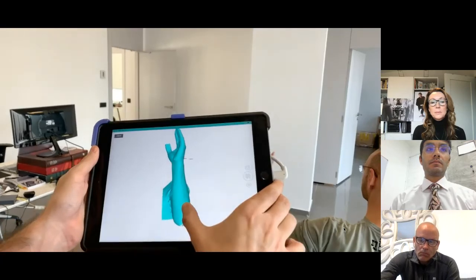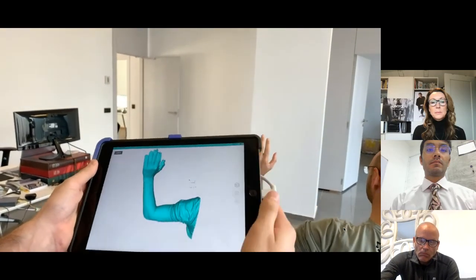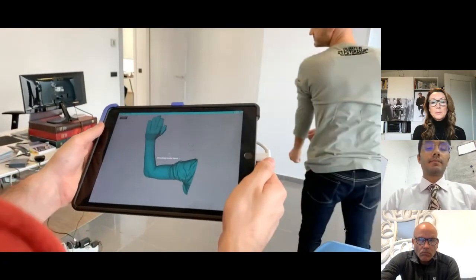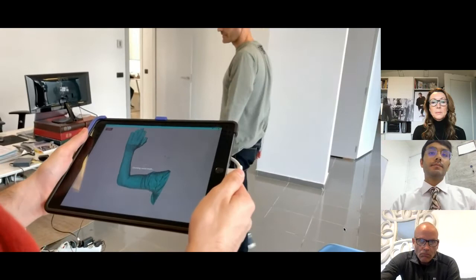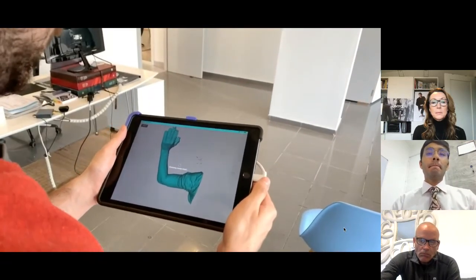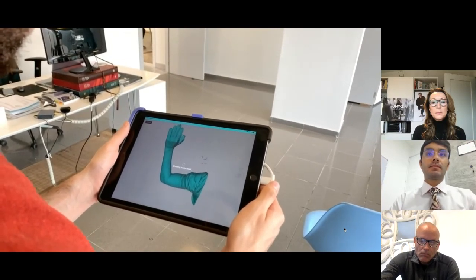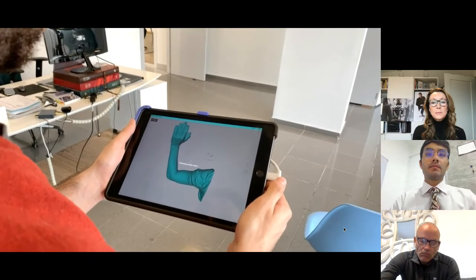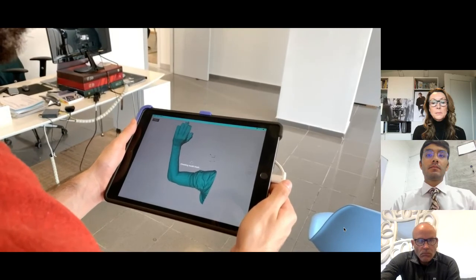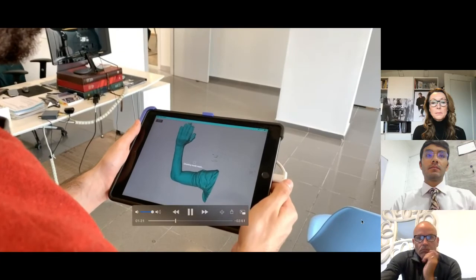The second process is when you have the scanner done, like you can see on the screen, we are going to proceed with the identifier, okay? What the identifier does is take the scan and check where all the parts of the anatomy that we scanned are. In this case, where are the fingers, where are the knuckles, where are the wrists, where is the elbow, if there is a scar, where is the scar, angulation, all this stuff, okay? This process takes more or less 30 seconds, something like that.